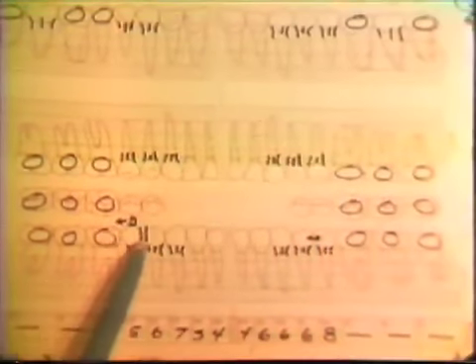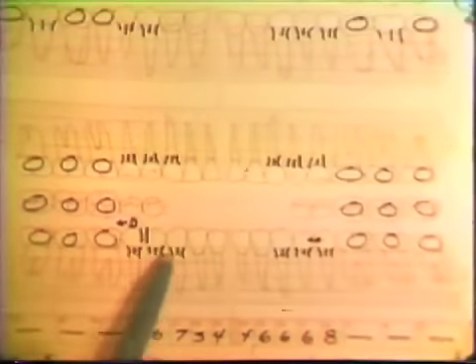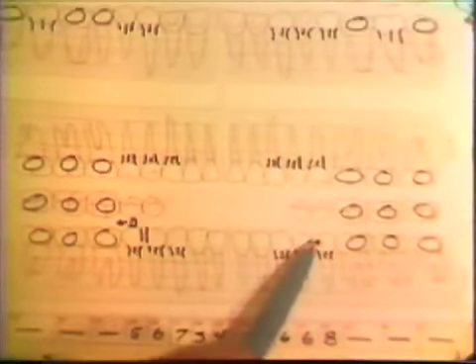Following the examination procedures, all information pertinent to treatment planning may be condensed and recorded on a single information sheet. Vitality readings of the remaining teeth are designated. Periodontal condition, degree of extrusion, carious lesions, tooth mobility, and any other information that has been developed from our diagnostic procedures are carefully evaluated and used to design a detailed plan of mouth reconstruction.